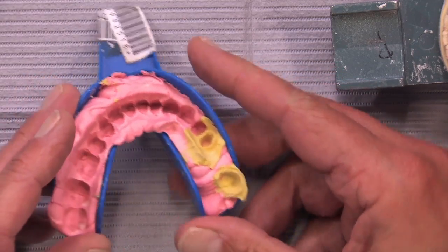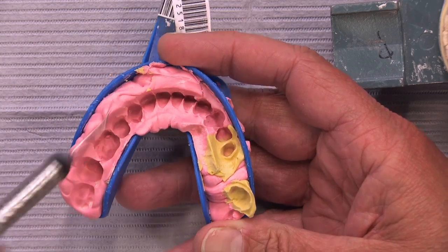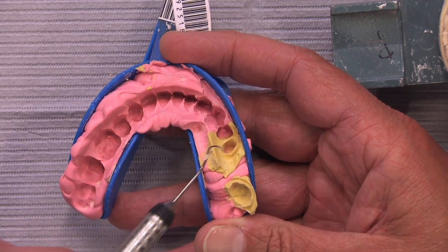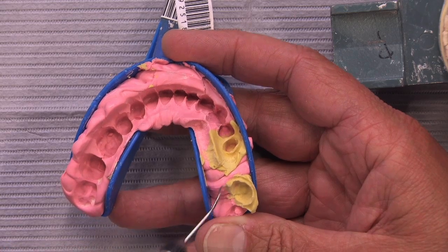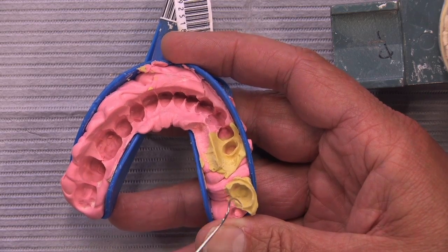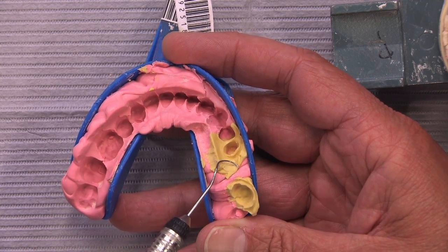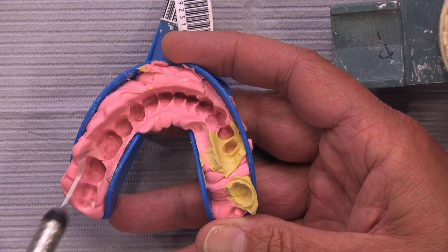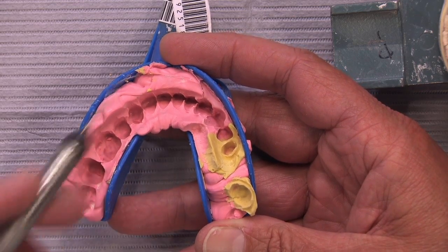But what would we have liked to see? Well, you probably know as well as I do, we like that simultaneous impression where these both set at the same time. And I always will take this syringe material and squirt it around here and this prep and then in between it as well. If my assistant hasn't handed me the tray yet, I'll even start putting some on the incisal edges of the other teeth just to cover those as well.